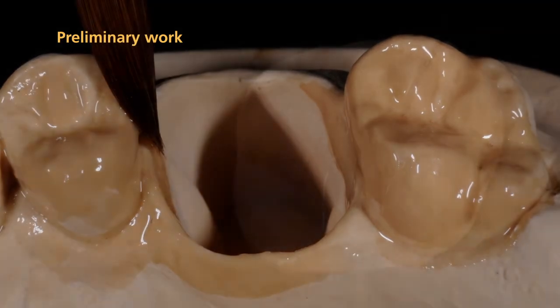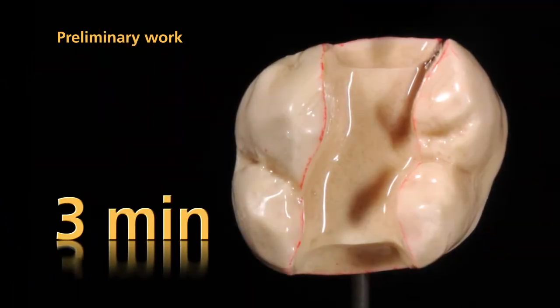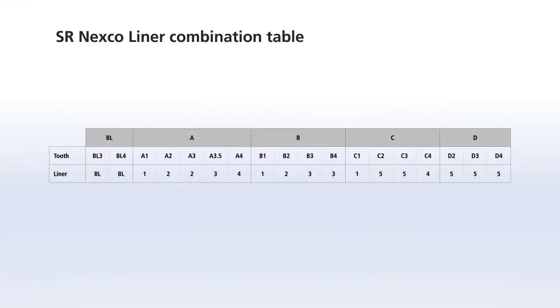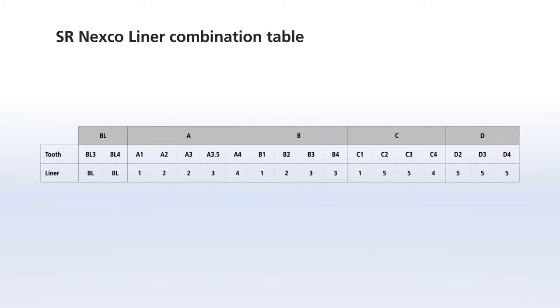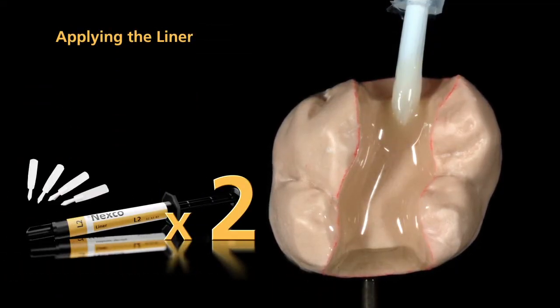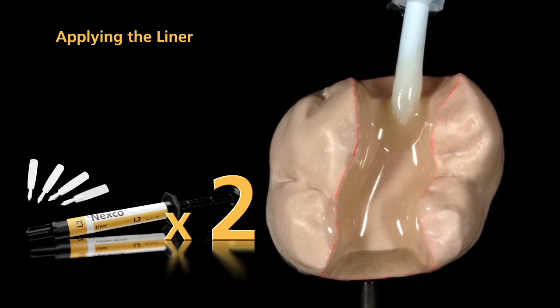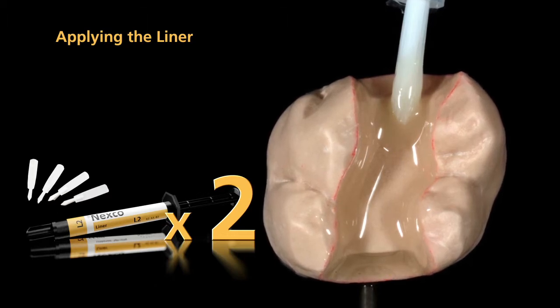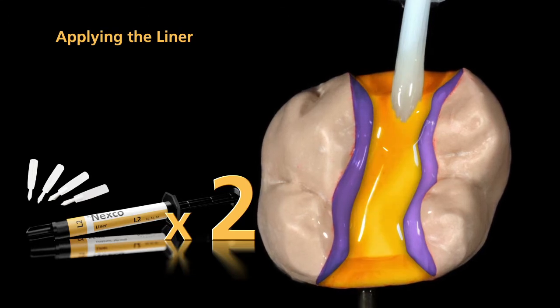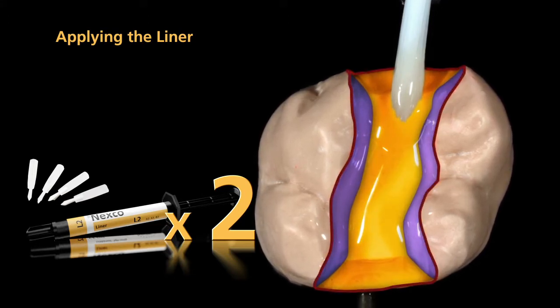Allow the individual coatings to react for three minutes each. To achieve the desired tooth shade, please observe the liner combination table. Basically, the liner is applied in two coatings. Apply the first layer of liner in a thin coating to the cavity walls and to the cavity floor. Do not cover the marginal areas at this step.